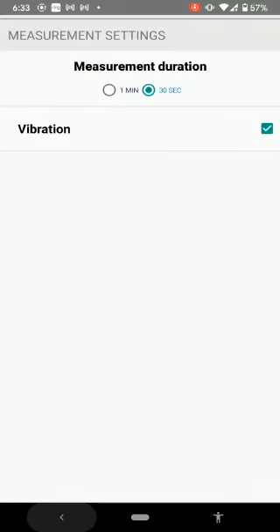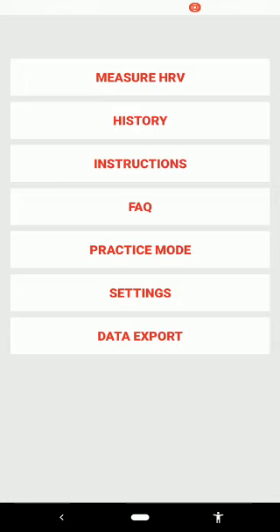In Settings, make sure your measurement duration is at the correct length. You'll see two options: one minute and thirty seconds. We want one minute, so click the white circle next to 'one minute.' You'll know it's selected when you see the green ticker next to it. Then click the gray back arrow at the bottom left to return to the home screen.